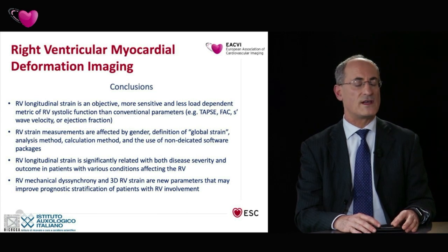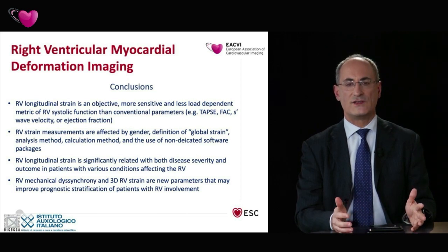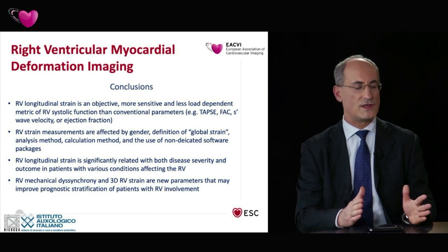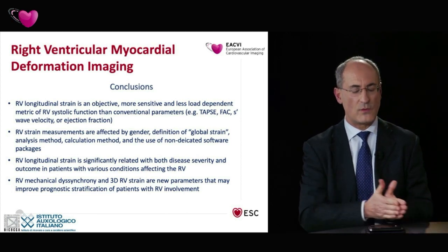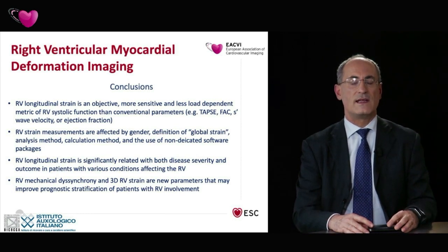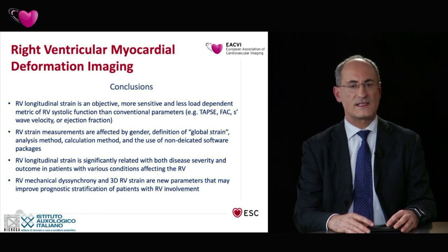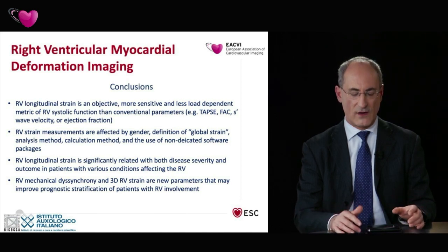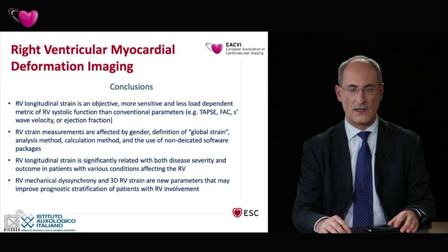Remember that the right ventricular strain measurements are affected by gender and also by the definition of the computation, different if we measure the free wall or the four-chamber strain. Then the right ventricular strain is important because it's related to the disease severity and also to the outcome of our patients.